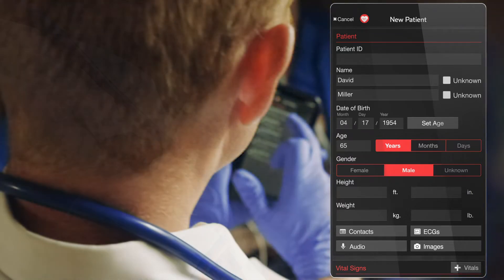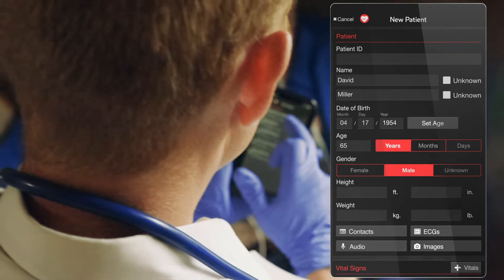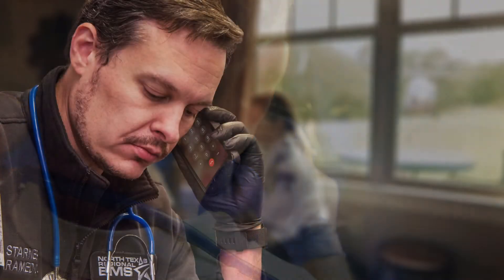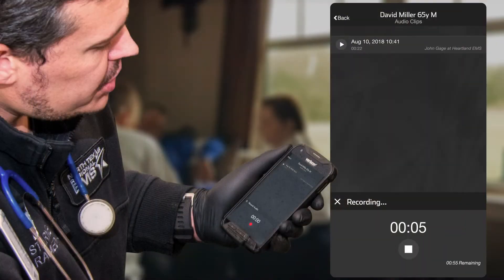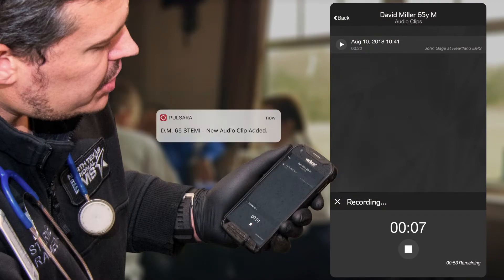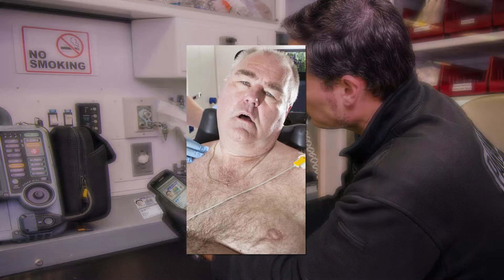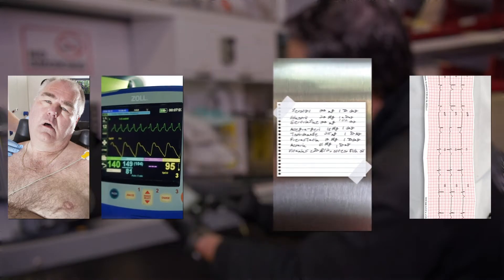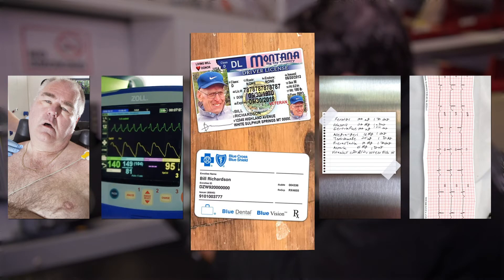To simplify the report, Pulsara also leverages multimedia functionality included in your average smartphone. For example, instead of a medic calling the emergency department and waiting for someone to pick up the line, they can quickly dictate their report as an audio clip. They can also use the camera to add images of the patient, the ECG, a monitor, a medication list, or even an ID like a driver's license or insurance card to assist with pre-registration.